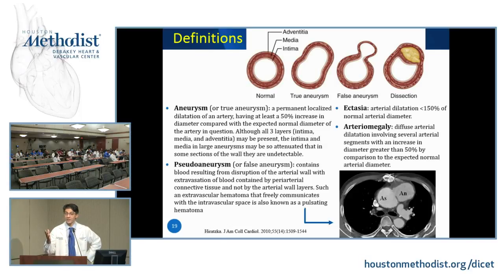It is definitely enlarged, but the definition of aneurysm is 50% greater than the mean. And that's the difficult part, defining what the normal mean is for this patient. Maybe it brings up the question of whether we need to revisit this definition of aneurysm.